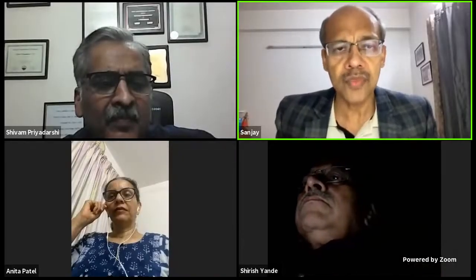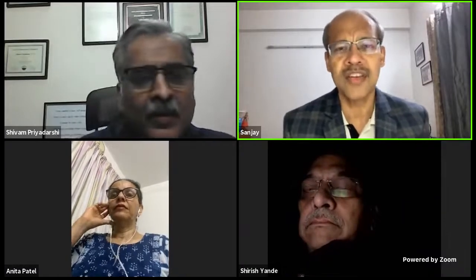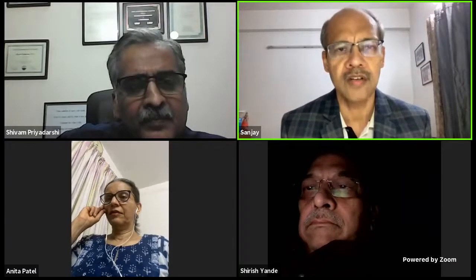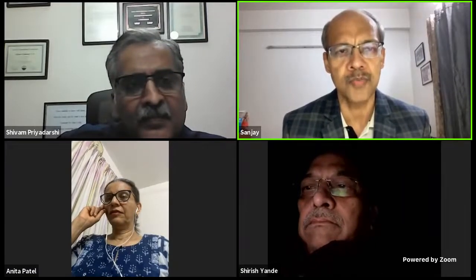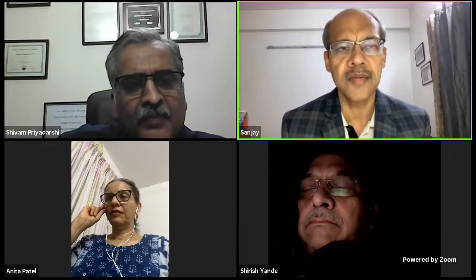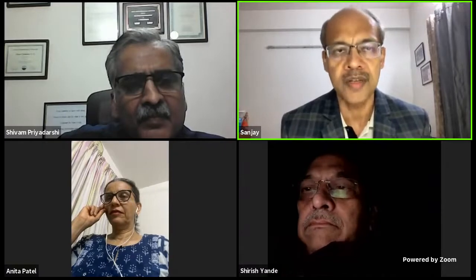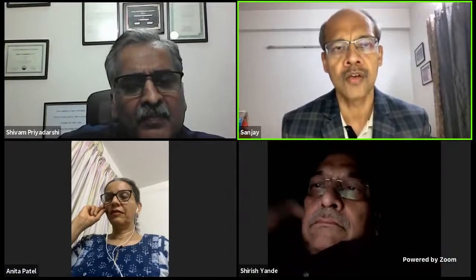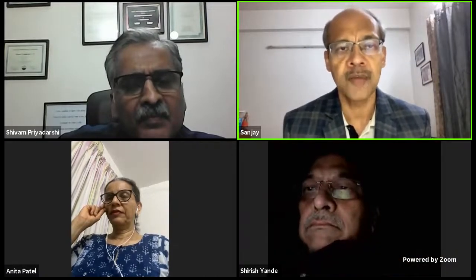Now, in terms of what preparation is to be done, I think the most important thing with urodynamics in children that I have found is that once in a while, you get a child who develops severe sepsis post-UDS. And it's critically important. My feeling, and this is anecdotal, I haven't studied it, we should study, and I hope at some point I can give you data on this, is that children who have upper tract dilatation or who have chronic kidney disease related to the lower tract are particularly at higher risk. And one such episode can give rise to the child in the ICU, AKI on CKD and so on.